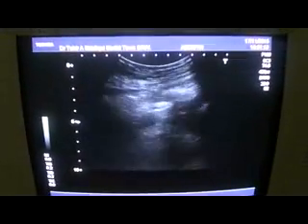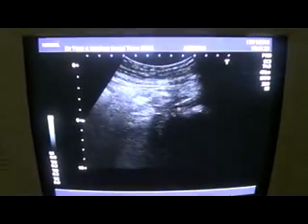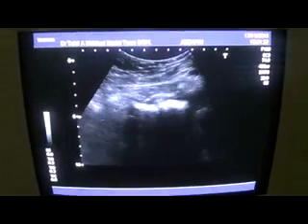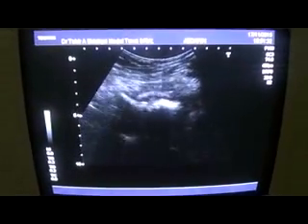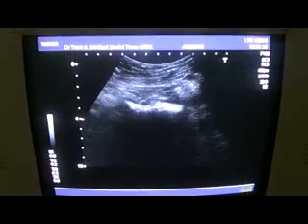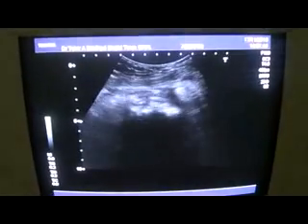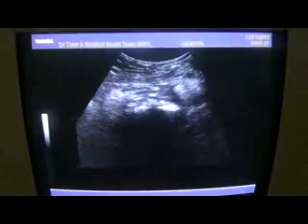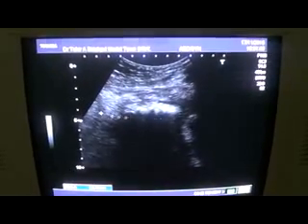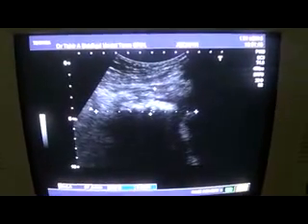Adherent bowels are seen that do not show any movement. Let us first study this bowel segment in the region of the right iliac fossa extending into the right lower abdominal quadrant. Let me take this full length. Now this is the longitudinal section of this bowel mass, measuring approximately 8.7 centimeters in length.